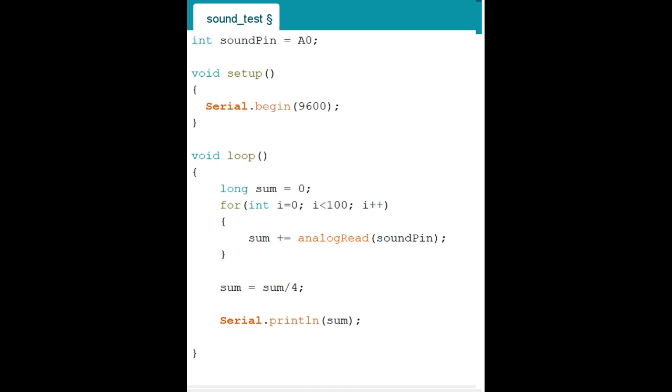And then now there's a brace, no indentation, and then you just enter. Then we have to give indentation. I normally press tab once, and you can do the space, but it has to be the same space whenever you use it. So there's a rule that if you have a brace, and then you have an indentation, and then if you have another brace under the one brace, you have another indentation. So the computer knows that, oh, you were telling me something under this command. We call this a command because I'm commanding the computer, right?